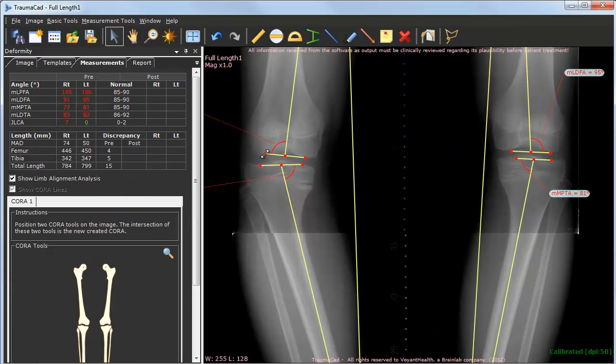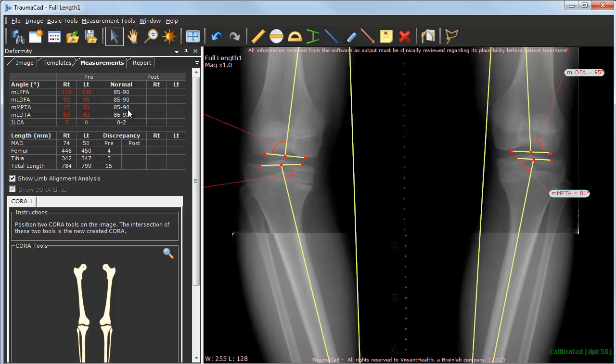Once completed, a table with calculated parameter results appears on the left panel. Each measurement is automatically compared to normal parameters published in the literature, providing instant evaluation of the patient's anatomy.